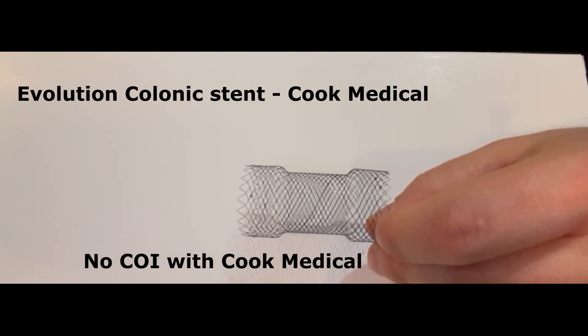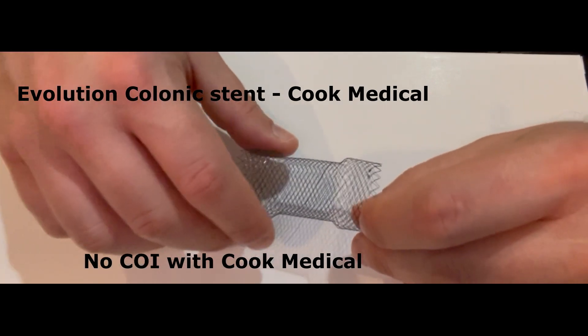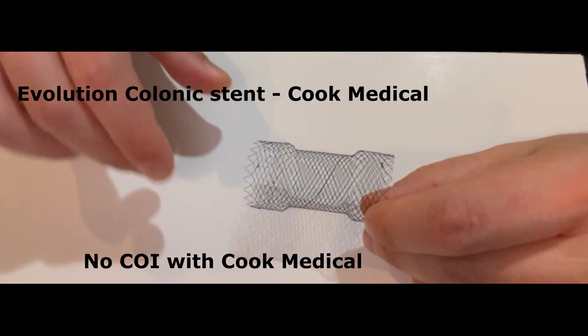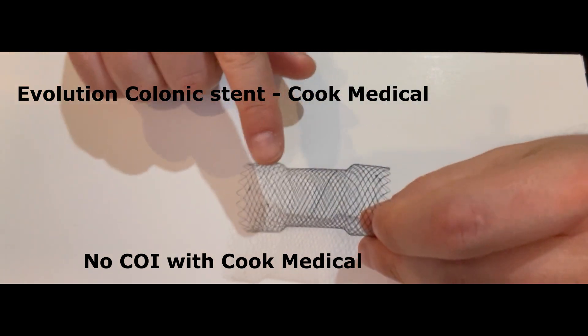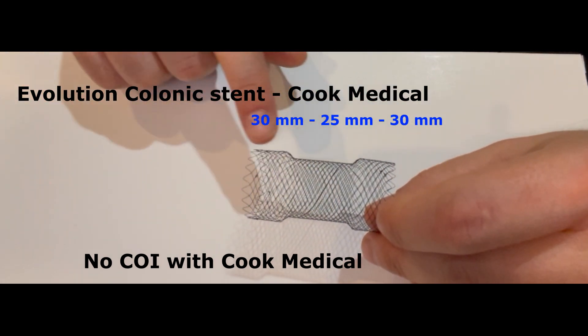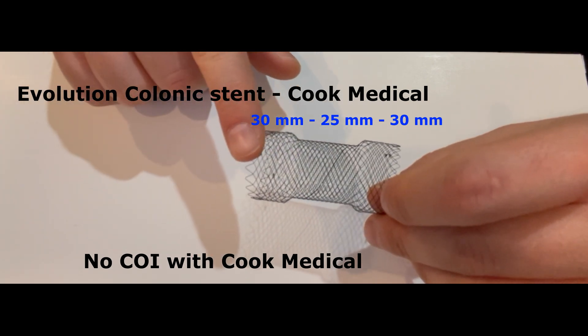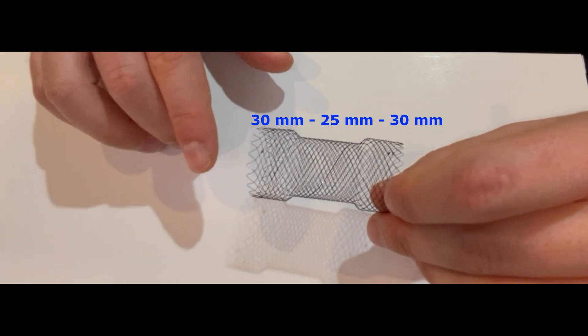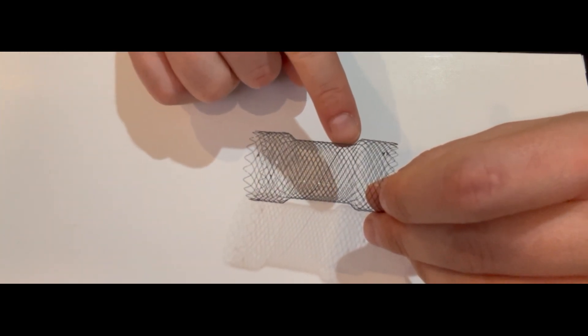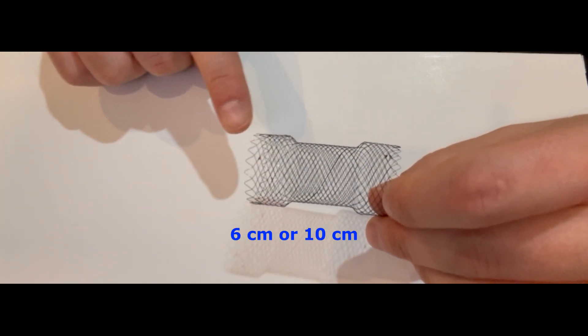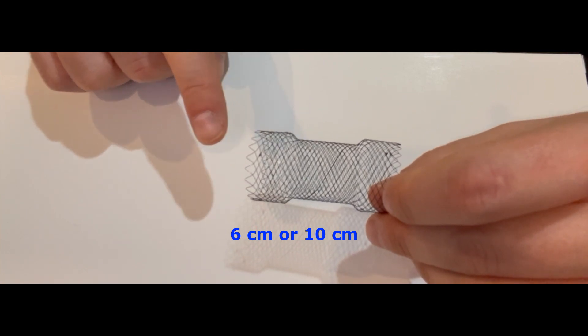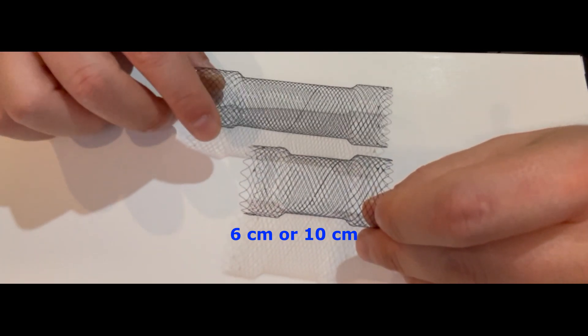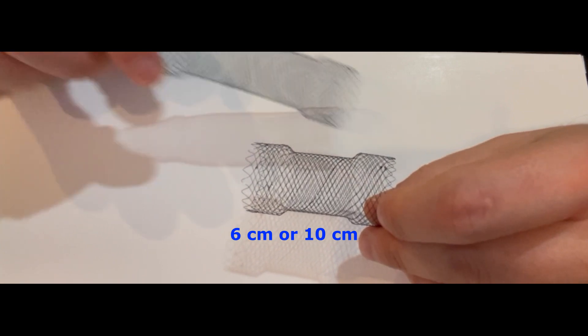The reason I like this stent is that it's self-expanding. It has two edges that are five millimeters larger than the body of the stent. This is 30 millimeters in diameter at the distal edges, and 25 millimeters in the body. The length is six centimeters, and it also comes in a 10 centimeter version.